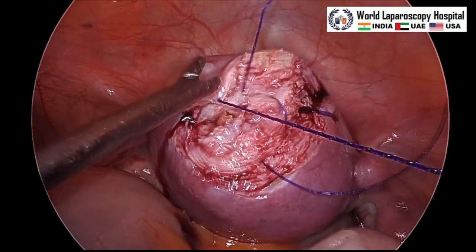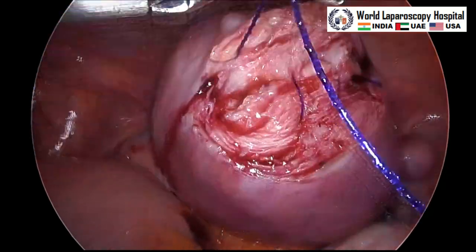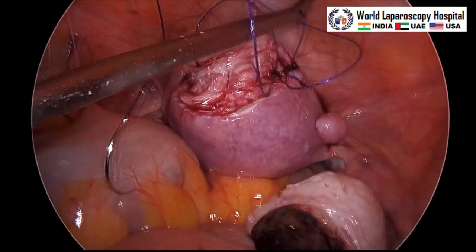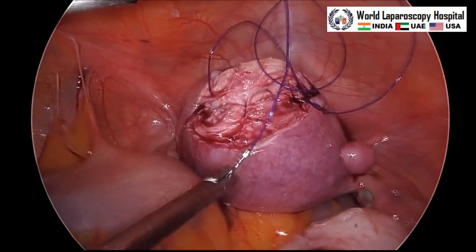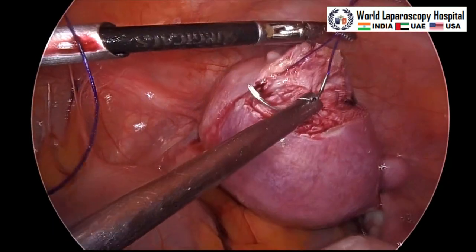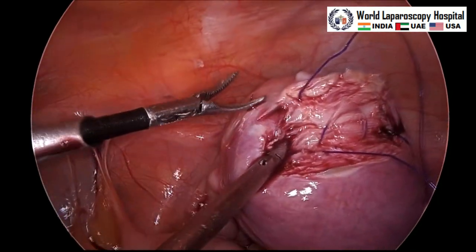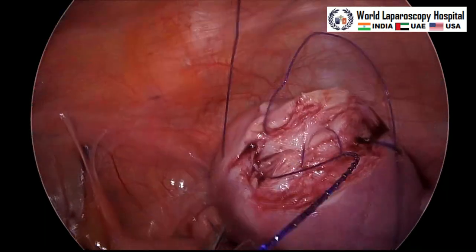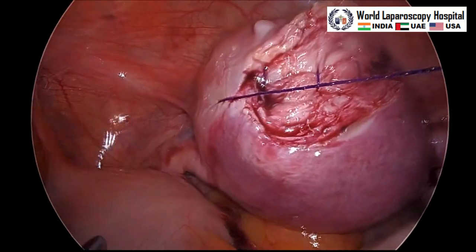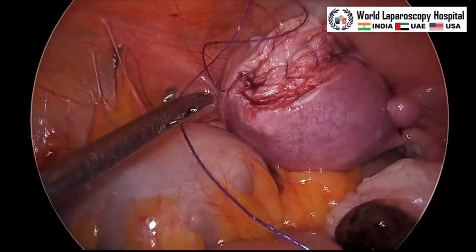So this is the first layer of suturing. And after that we will bring the needle again out of the muscle and it will come out through the serosa. Healthy serosa. And then we will start returning back. In this case, during returning back, baseball suturing was performed.